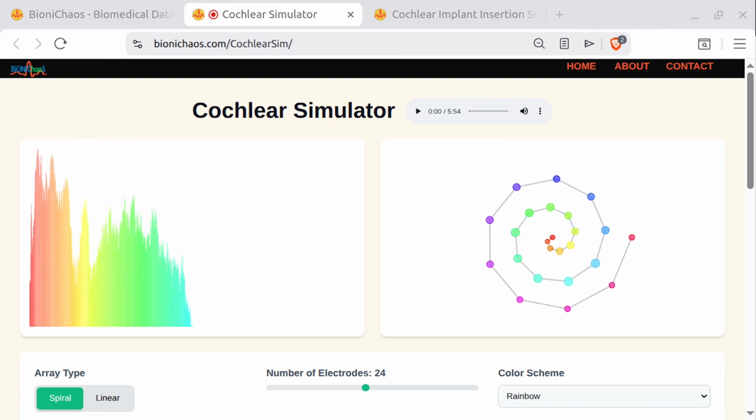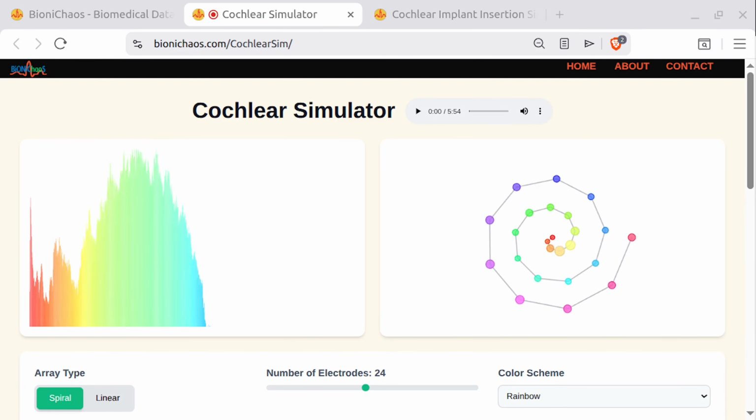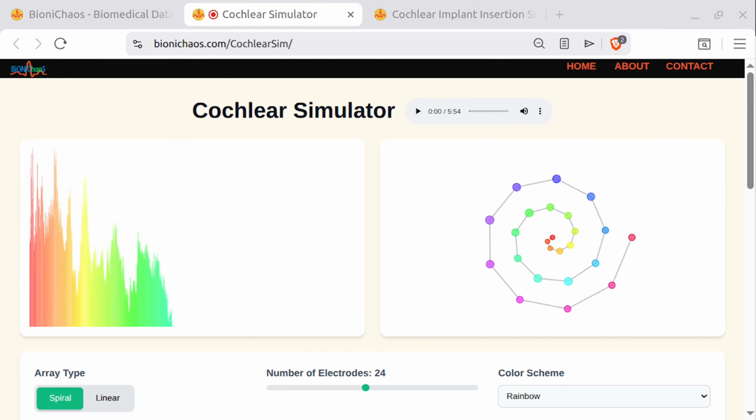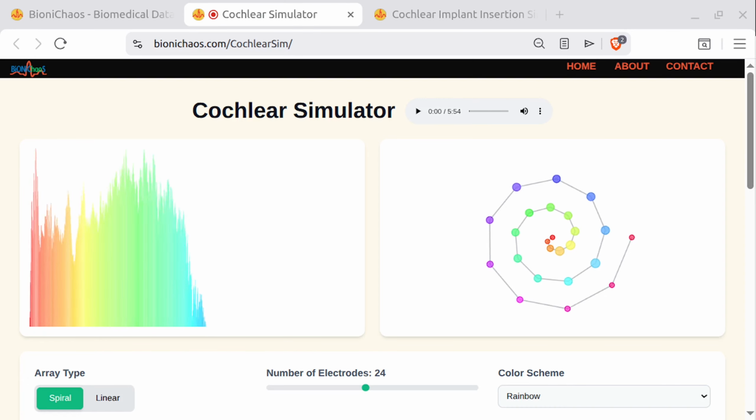Right. But let's step outside the biology for a moment, too. Beyond the nerve damage and the vertigo, we really need to examine the immense, permanent technological burdens. The hardware. Yes. We are talking about what it means to live your daily life entirely reliant on an external implanted machine. There's a profound psychological trauma tied to device dependency. You're referring to the failure rates. I am. The clinical data shows device failure rates between 5 and 12%.